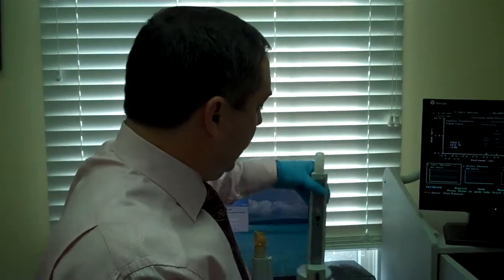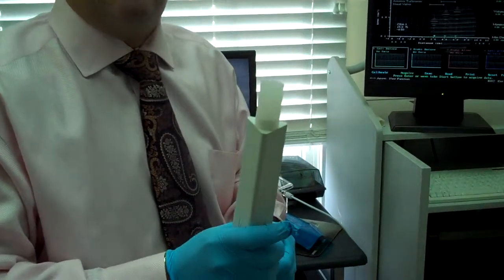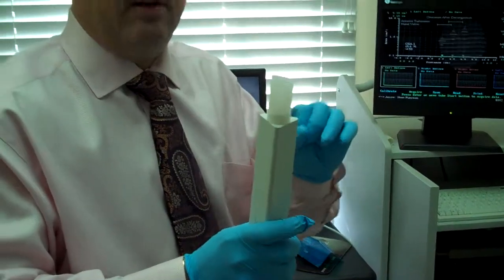The technology we're going to be using is called a rhinometer and a pharyngometer. It measures how wide the airway is in the nose and also how wide the airway is in the throat. The rhinometer is simply a device. It's like a wave tube. It's a very expensive fish finder, basically, and it sends out acoustic waves that are bounced back and captured by the computer, and it gives us a readout of how wide in centimeters, cubic centimeters, the person's airway is.